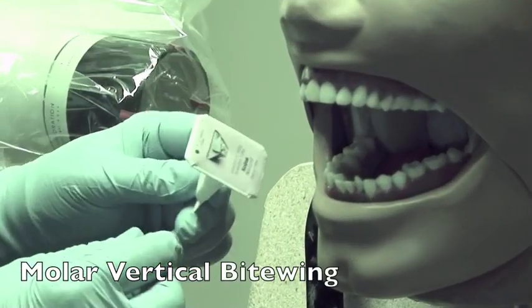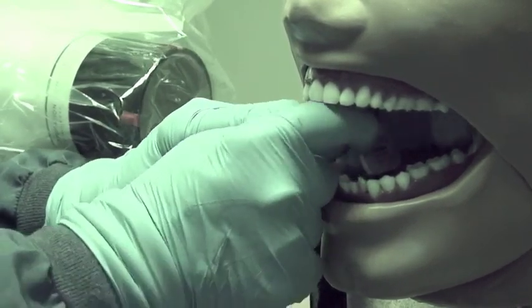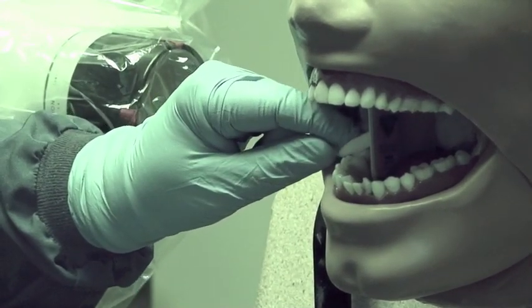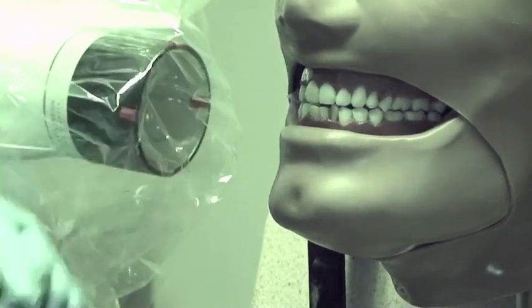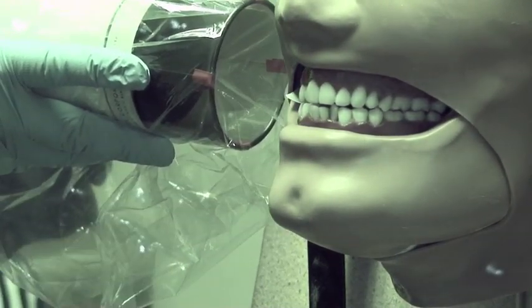To see the molar view again, we're going to look at how many molars we have — we have three. So we start at the distal of the last molar to get that two to three millimeters of bone, then have the person bite down. You would be aiming between the third and second molar, then check your occlusal plane.